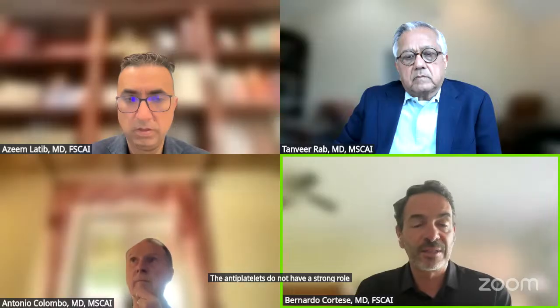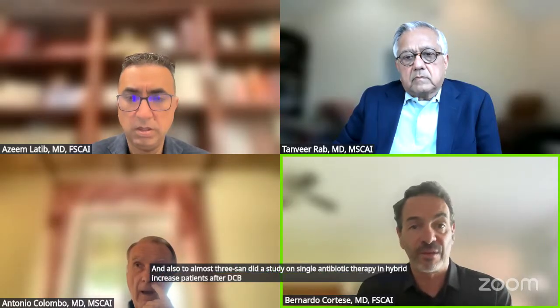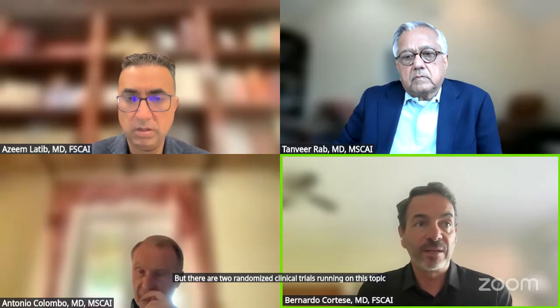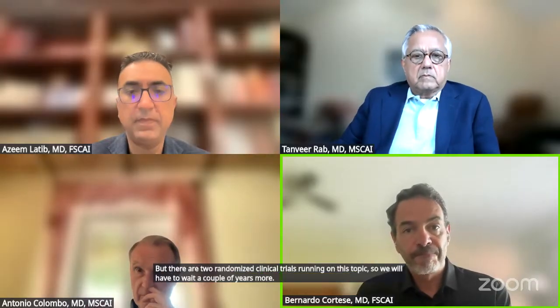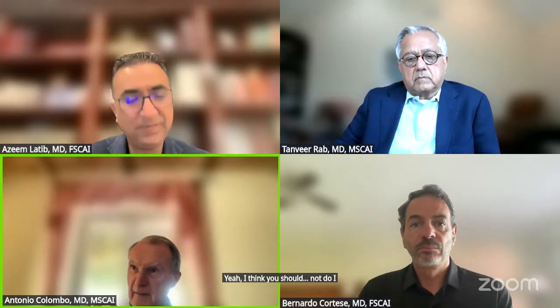We have run a study, and also Thomas Rissanen did a study on a single antiplatelet therapy in high bleeding risk patients after DCB, and it's safe. But there are 2 randomized clinical trials running on this topic, so we will have to wait a couple of years more.